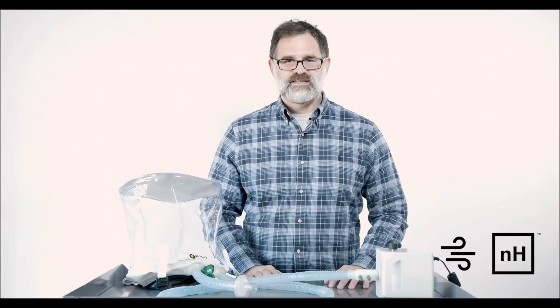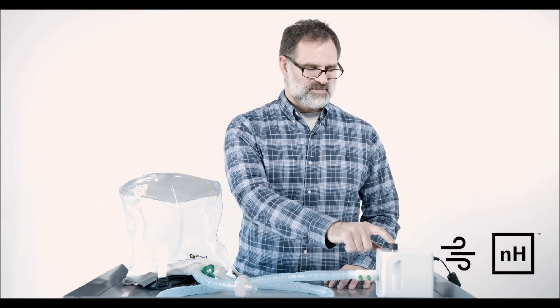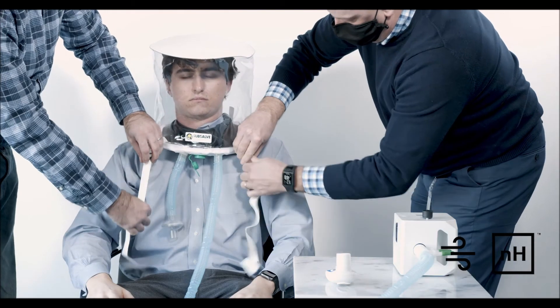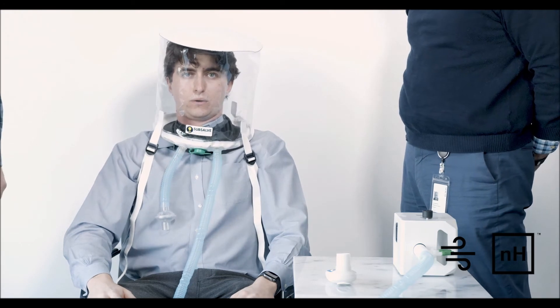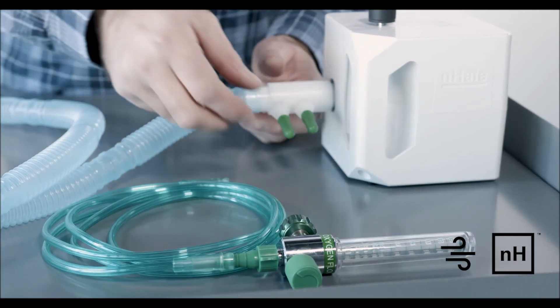First, we open the service port on the oxygen treatment hood. Next, start the Inhale — push the button once to start flow. The device defaults to 8 centimeters of water pressure. The hood is placed on the patient, adjusted for comfort, and the service port is closed. The patient now has positive airway pressure, and their exhalations are filtered from the healthcare provider's work environment.